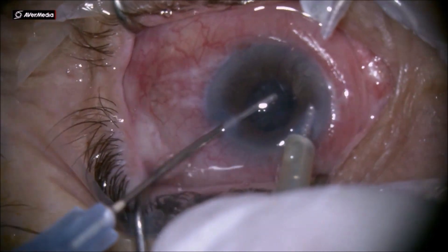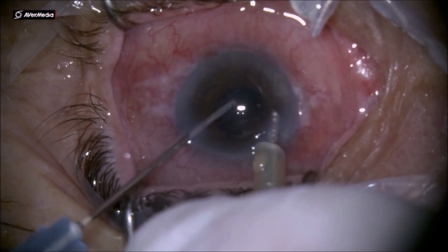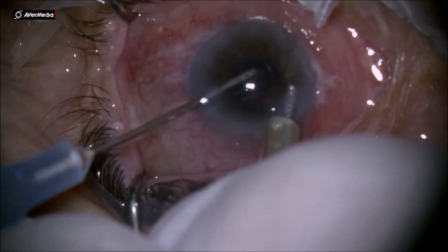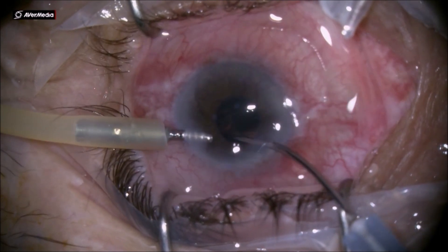As you can see, at the six o'clock position there are two large new vessels, and around the pupil margin there is a ring-shaped neovascularization.